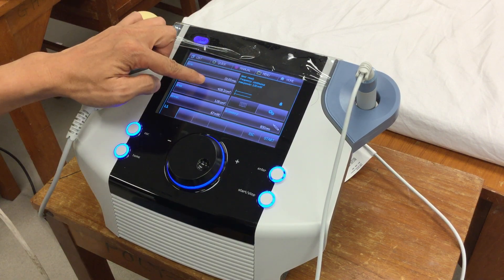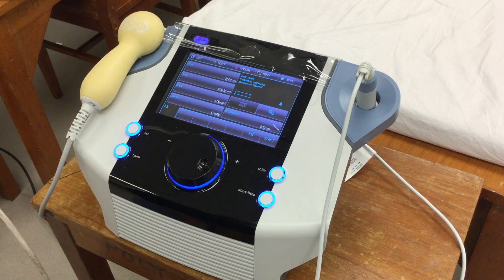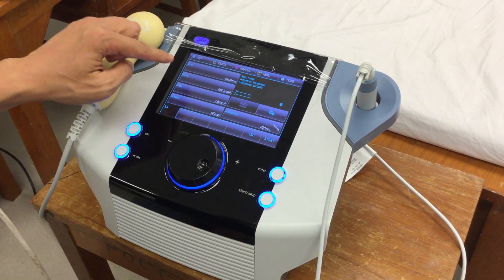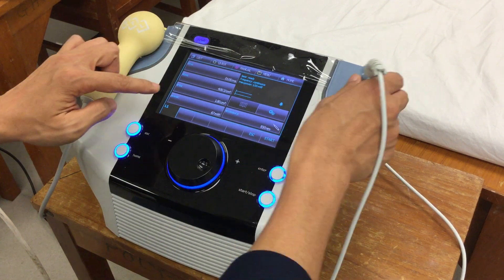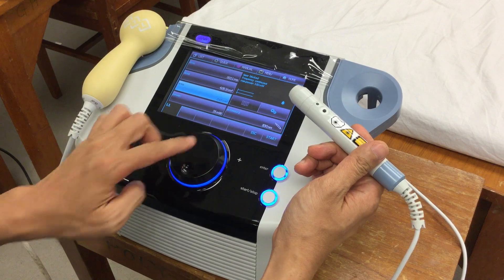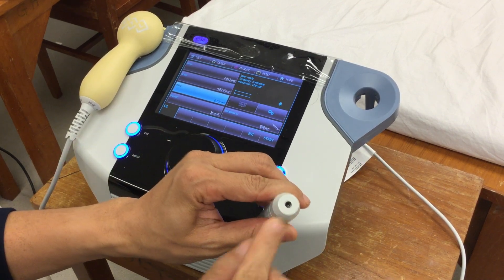The time set depends on what energy dosage you want — for example, 4 joule per cm². If you want to use the probe, then you have to set it to 0.1, which is the smallest area.